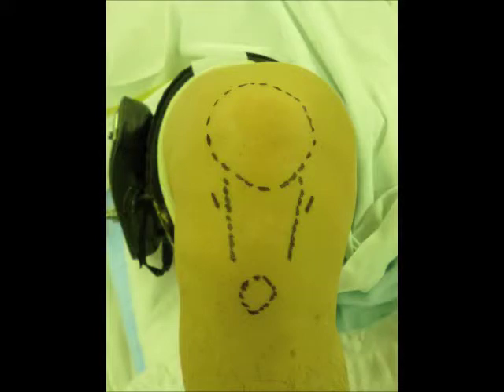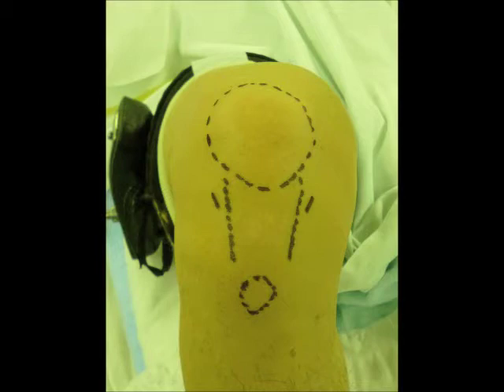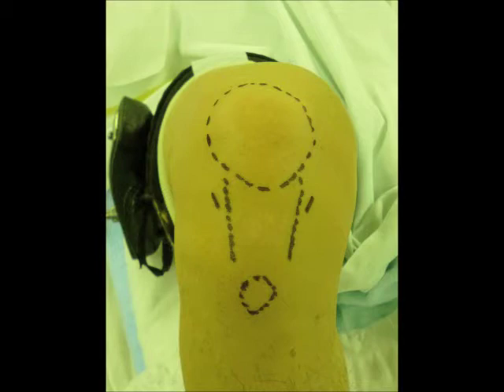Thereafter, the patient is placed in the supine position with the standard leg holder to allow the full range of motion, and routine arthroscopy is performed using the standard anterolateral and anteromedial portals.